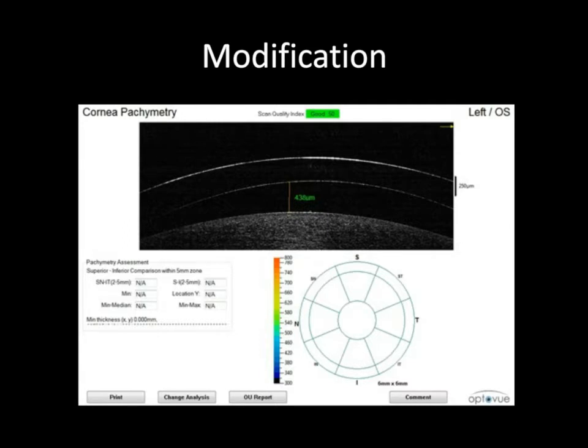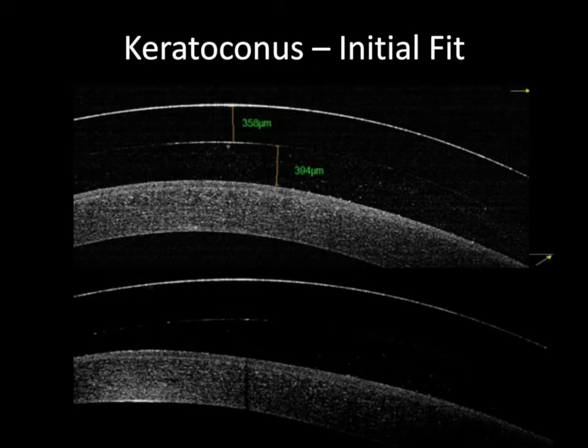Now, what's also important to understand is that, in particular with our keratoconic patients, all I've done here is, in the top view, take a scan directly horizontal over the lens and the cornea, and in the bottom picture, what you see is a pachymetry scan on an angle, and you can see that in the top right-hand portion of the picture. You can see the angle that I took the scan, and you can see where that cone is actually approaching the lens a little bit more closely. I want to make sure that we're still clearing there, and I have the ability to do that.